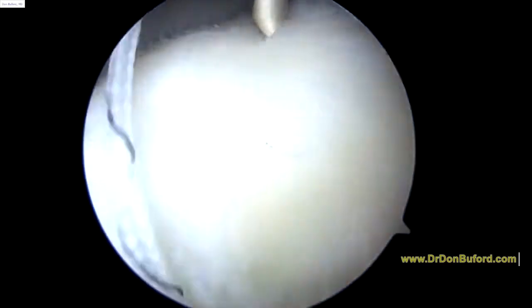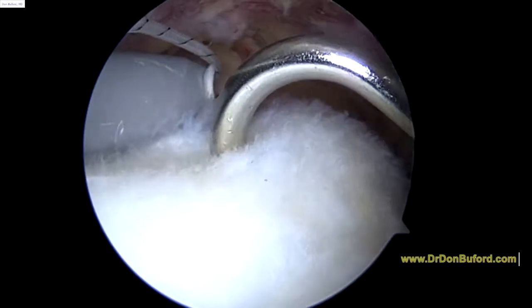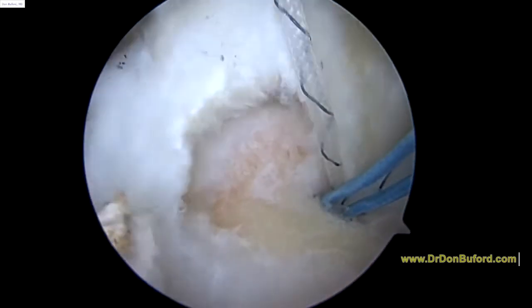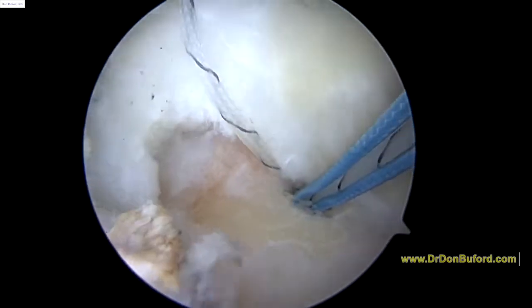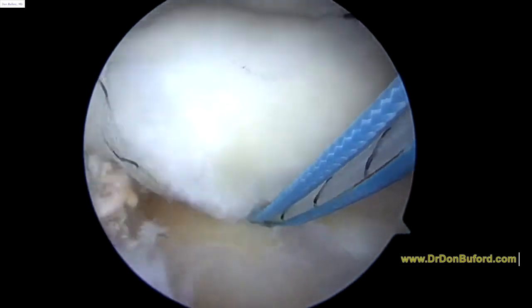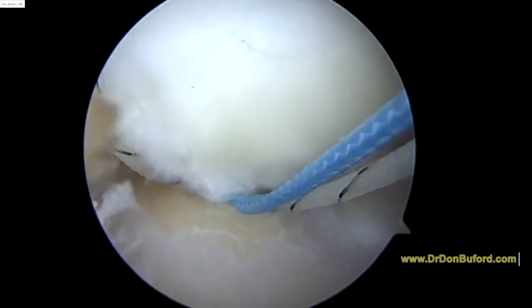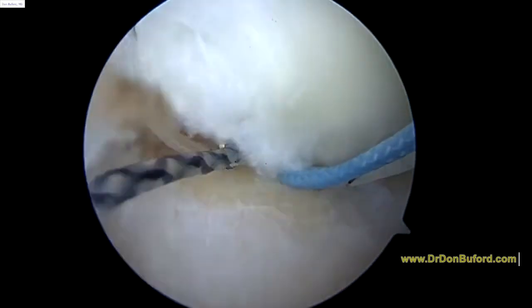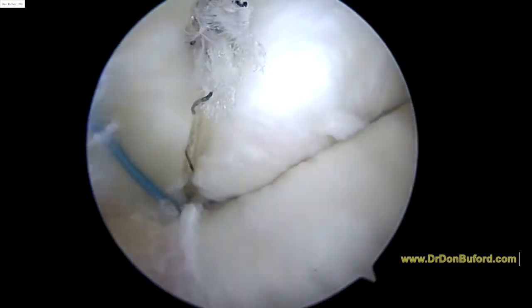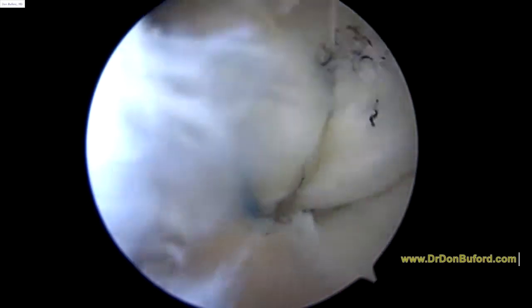I'm going to rotate. I'm going to look for the muscle tendon junction right about there. I'm going to come in a little bit lateral to that, to make sure I get a complete grab of the tendon. You can just see it coming out there. That's a pretty good full thickness bite. So we've placed one anchor and 3 sutures. You can see how we're holding down that cuff now. I'm rotating, and hopefully we'll give that a chance to heal.